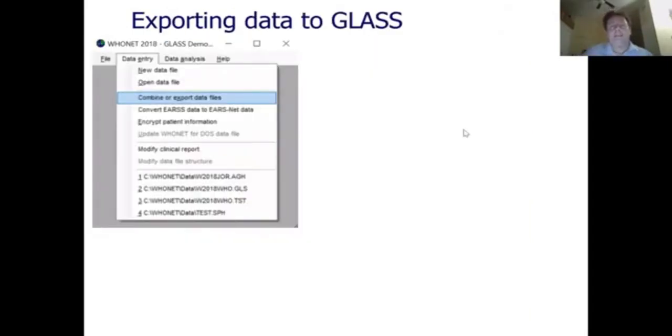So that's all about getting data into WHONET and a little bit about data analysis. In this presentation, I will also demonstrate using the WHONET software as a live demonstration how you can export data from WHONET to GLASS. So what you're looking at here is a screen grab from the WHONET software. Under the data entry screen, you see it says combine or export data files.